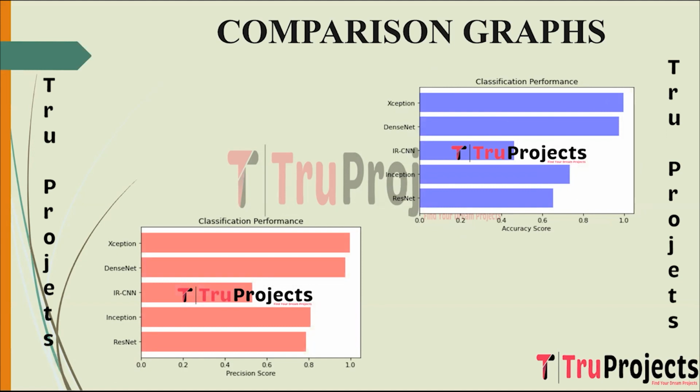Accuracy is a measure of the overall correctness of a classification model. It calculates the ratio of correctly predicted instances, both true positives and true negatives, to the total number of instances.